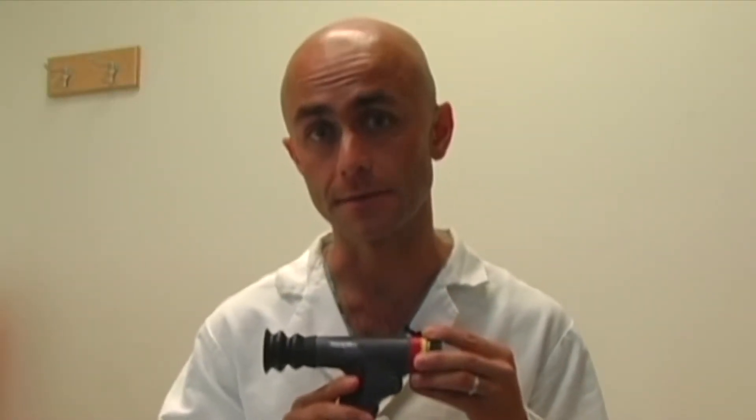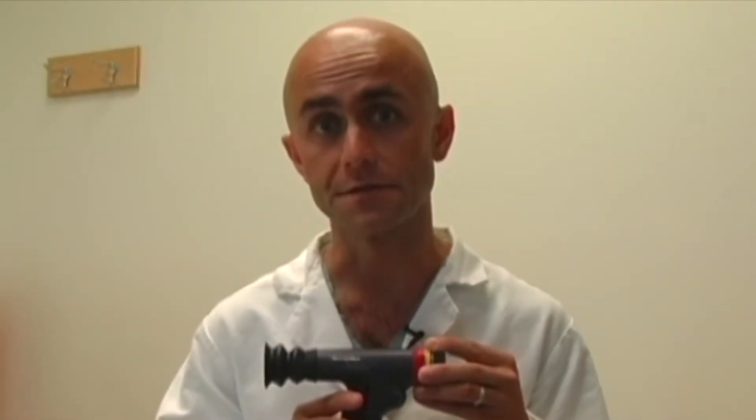This is the Welsh-Allen Panoptic Ophthalmoscope. It provides a five times greater view of the fundus than a traditional ophthalmoscope and allows complete visualization of the fundus without dilating the eye.